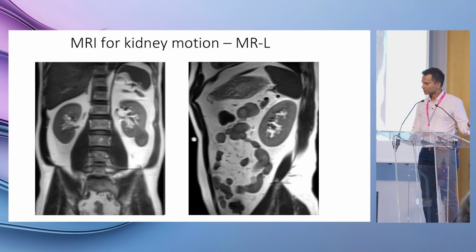In fact, our previous speakers spoke about MRI LINAC, and I think that is a really good solution to be able to visualize the kidney. It's probably the perfect solution to be able to see something in real time and be able to treat it at the same time. Although we also discussed that the treatment times are quite long when we're gating during MRI LINAC treatments, still it's a really optimal solution for this upper abdominal area.